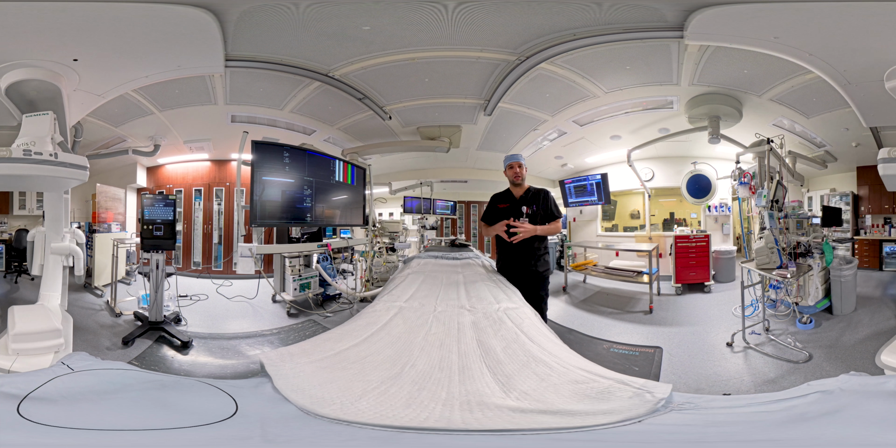After I am happy with the results of the procedure, this is the time where we complete the procedure. Since you've had access in your groin, I will use some collagen plugs, which will make sure that you don't bleed after the procedure. Without those collagen plugs, you would have to stay 6 hours flat or 8 hours flat. But those collagen plugs will allow us to have you laying flat for 2 to 4 hours and be able to go home same day without the risk of bleeding. After I do that, we will wake you up, and after that, you will go back to the area where you will recover.